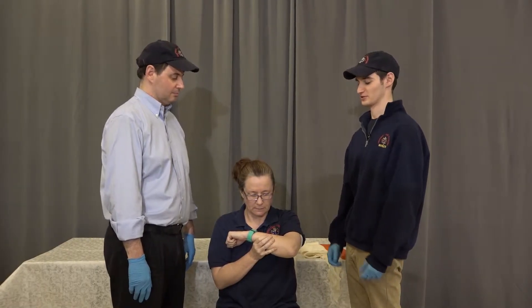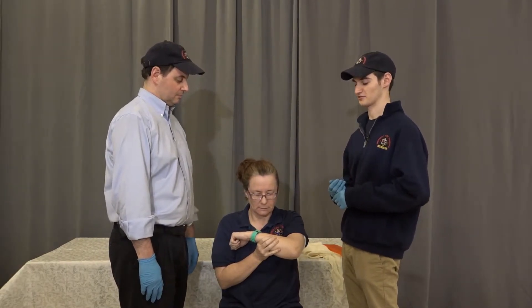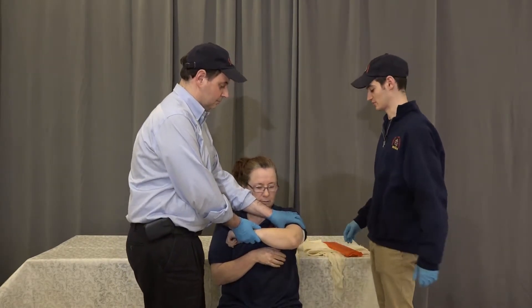Joint immobilization of the elbow. We're going to do BSI scene safety. We have a stable patient complaining of pain, swelling, and deformity to their arm. My partner is going to come on scene and stabilize above and below the injury, and the area has already been exposed.